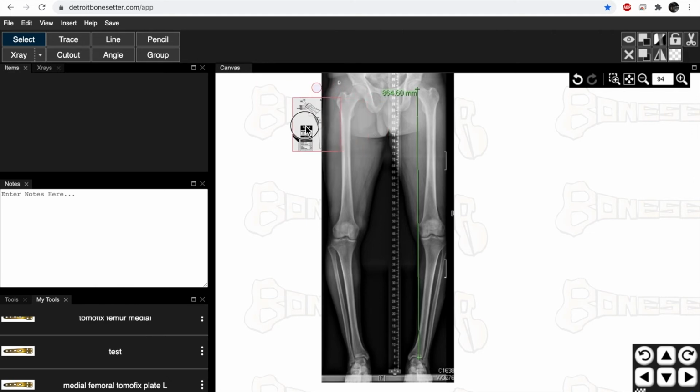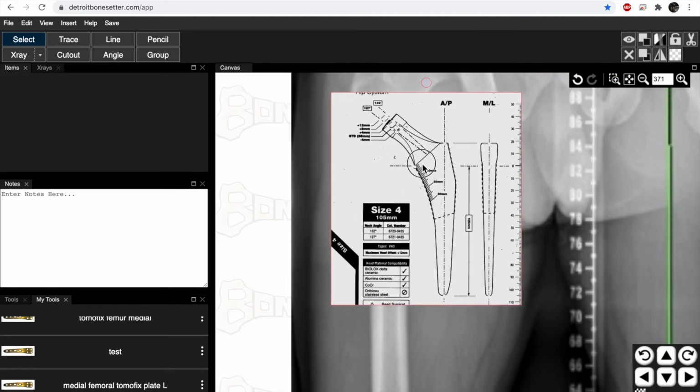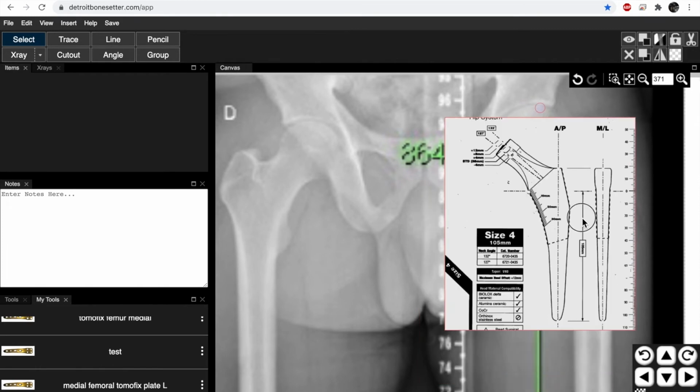Now you can see it's going to be behind. So let's bring it forward. There you go. And you can see that here is a template. Now, well, I can't see through it, right? And it's for the wrong hip. But, okay, let's bring it over to this hip. And I can't see through it.